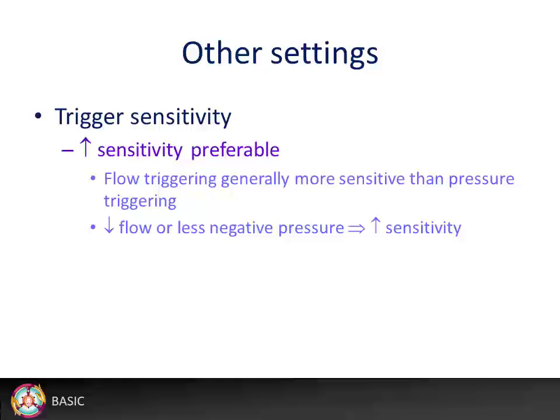In general, increased sensitivity is preferable to improve patient-ventilator synchrony, i.e. to stop the patient fighting the ventilator. It may result in false or auto-triggering, i.e. the ventilator detects what it thinks is an attempt by the patient to breathe, although the patient is apneic.